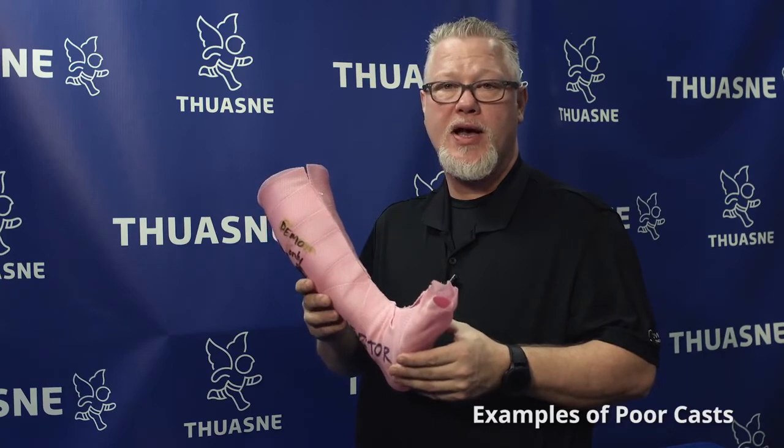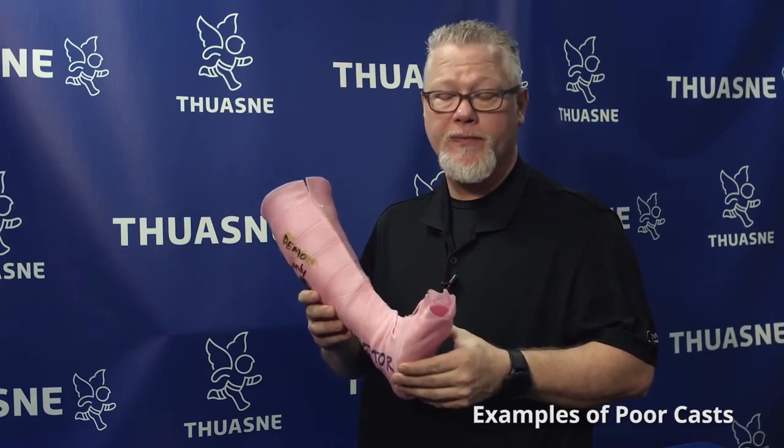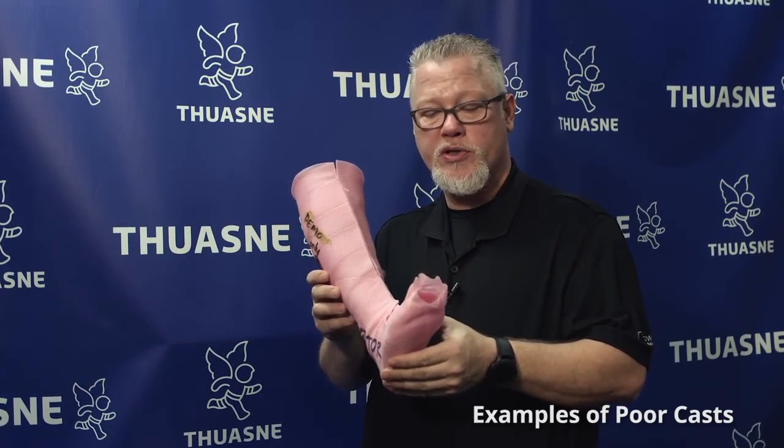Now we're going to present you with a set of bilateral casts that are not symmetrical to each other. And according to this work order, these casts should be symmetrical. So I'm going to, without using the alignment board or the grid, just give you simple examples of the importance of left matching right. Using prosthetic alignment principles, we want to ensure that the angulation and the stiffness of the devices are accurate.